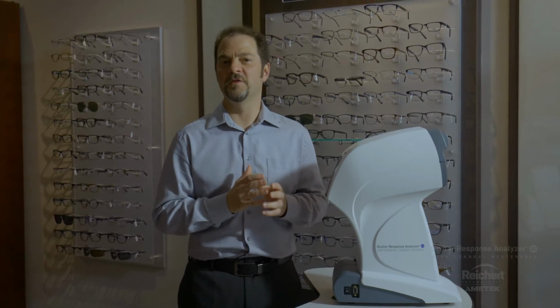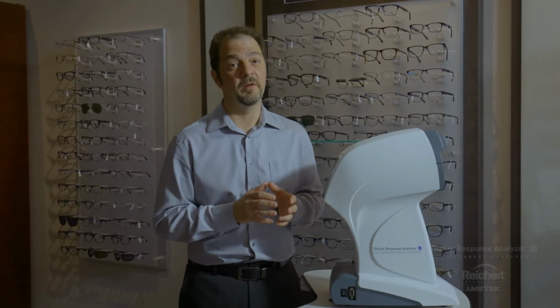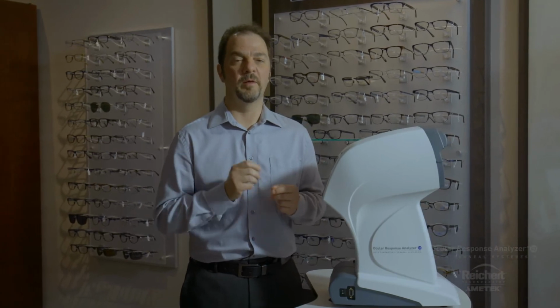So this subjectivity of Goldmann tonometry has lulled clinicians into a false sense of IOP symmetry between the two eyes over the years. But what we've learned in recent studies, including implantable pressure transducer studies in primates and other things of that nature, is that the intraocular pressure fluctuates much more dramatically and also very rapidly than we have previously appreciated. So it's not unlikely to actually have a pressure difference between the two eyes.